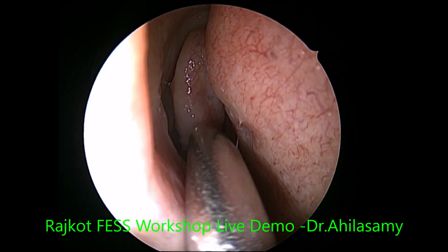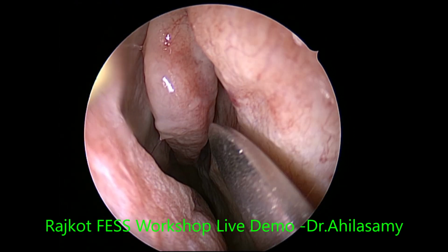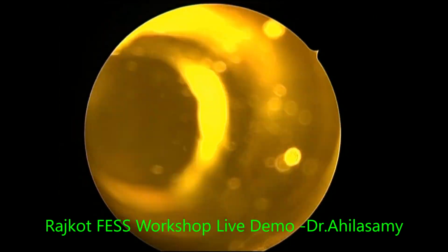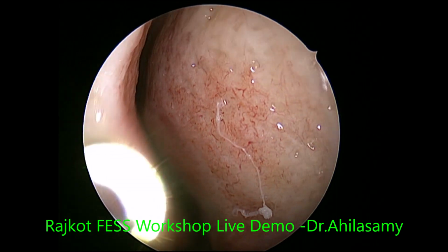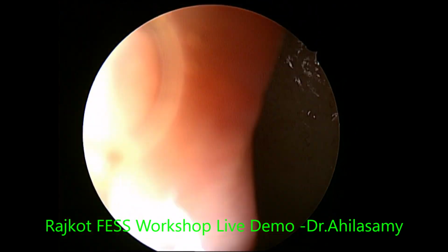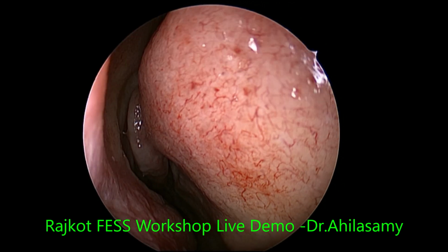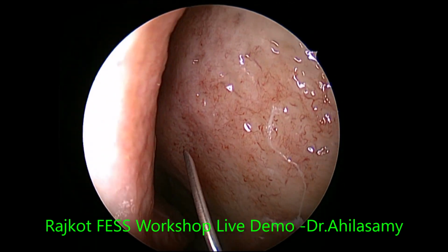Still, we are not very confident of the diagnosis of this patient, even though MRI and CT picture look like a fungal sinusitis. It's a 74-year-old man. It can be even a tumor or a malignancy. As a first step, I am giving the sphenopalatine block.